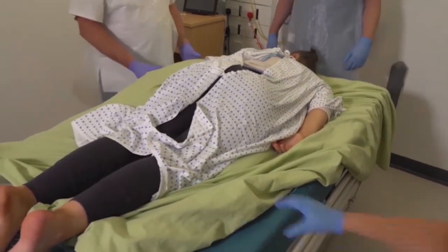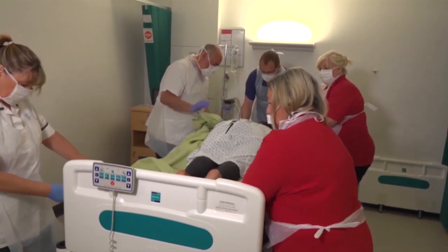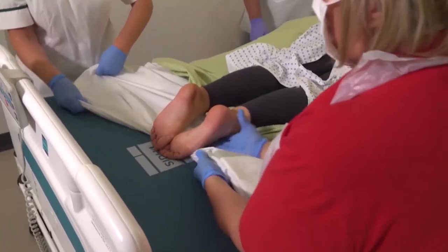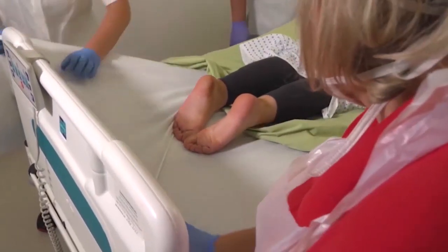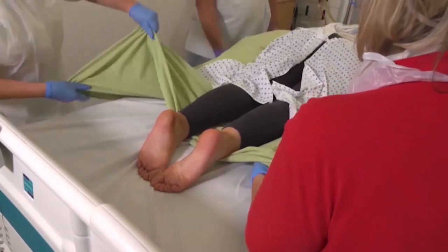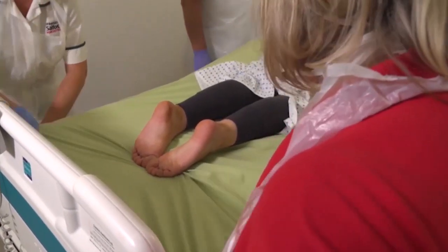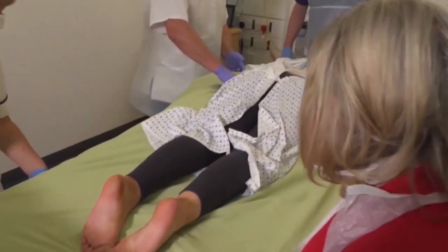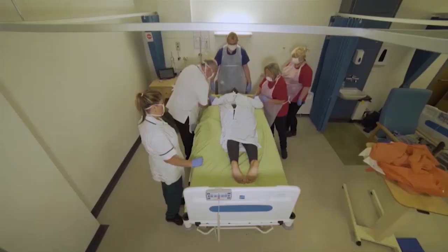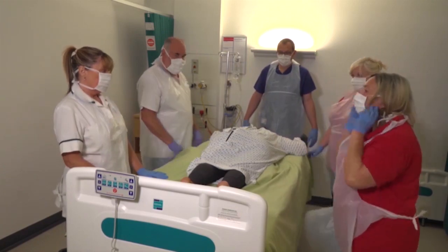We can now straighten the bottom sheet out. The bottom sheet needs to come out. You need to straighten that green one out as well. Rotate around and position the hand. The person is now in prone.